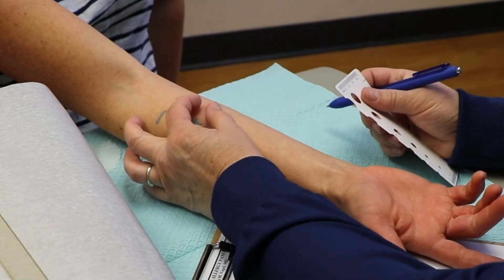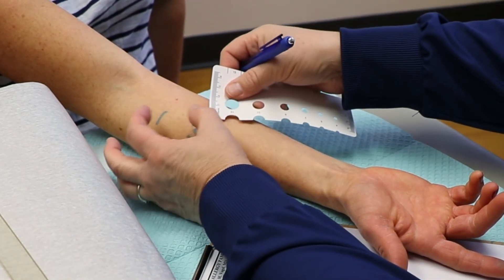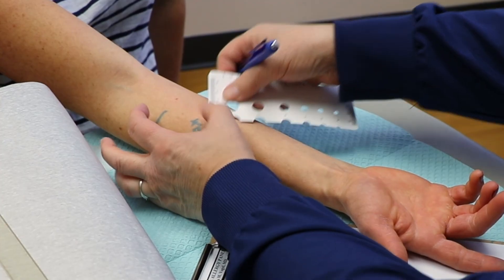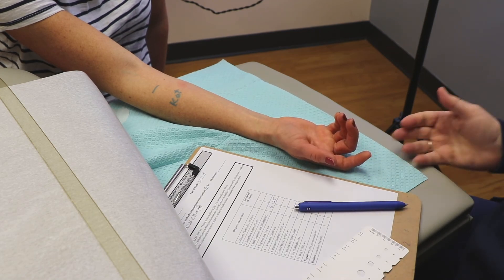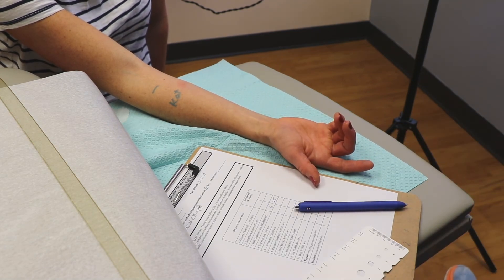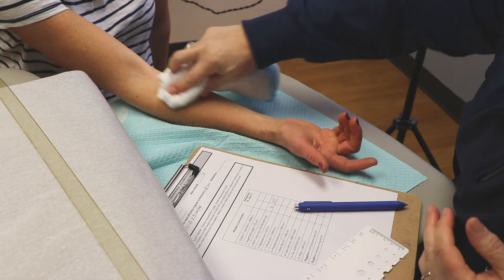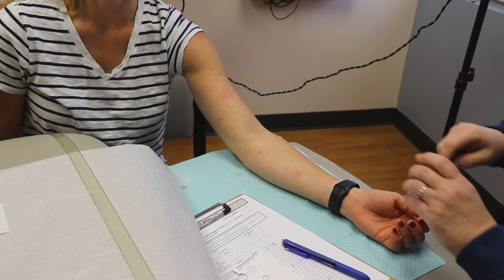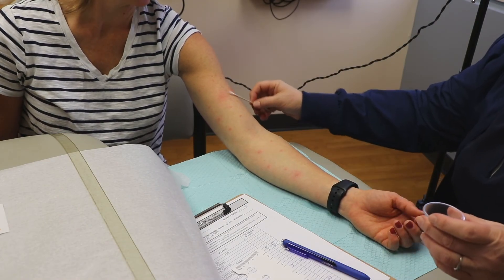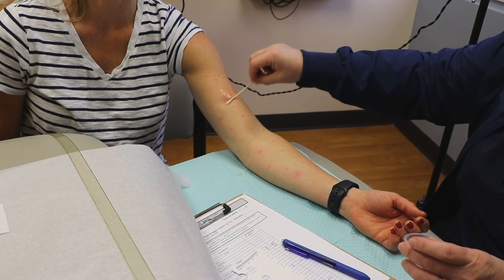After 15 minutes, the nurse will measure any positive skin reactions. There will be two different measurements. First, the wheal — what looks like a bug bite or bump — will be measured. Then the flare, which is the redness around the bump, will also be measured. Any allergens that are reactive will be compared to the positive control. Once all of the measurements are complete, everything is wiped off, and if the skin still feels itchy, some topical hydrocortisone cream can be applied to help relieve the itch.